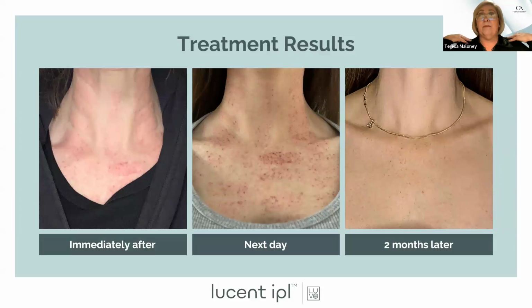It's antifungal, it's antibacterial. I grew up smelling like a pickle. My mom would put straight vinegar on my sunburns and it just soothes and relieves it and draws out the heat. It's the same with an IPL treatment. If I was using it in an ablative situation, I dilute the vinegar. When I'm using it in a non-ablative situation, I don't have to dilute it.